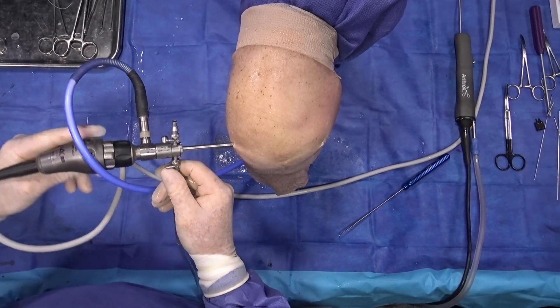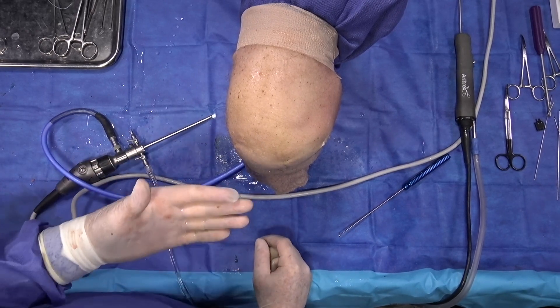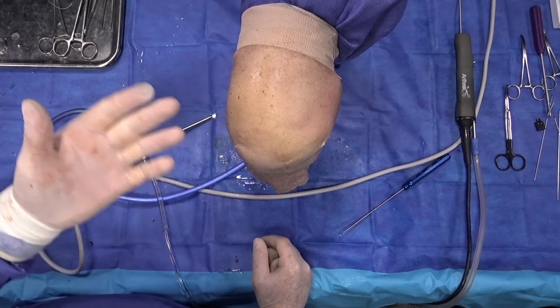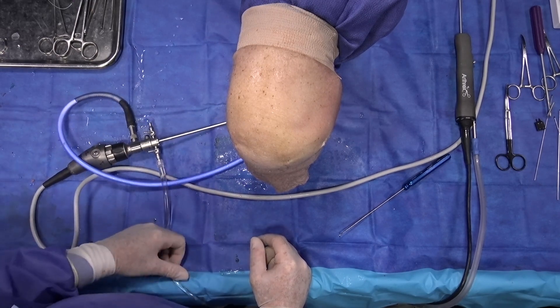At this point we perform another diagnostic ultrasound to assess the stability of the repair, confirming reduction of meniscal extrusion and overall stability. We then close the portals, place the patient in a brace, and start the rehabilitation process.